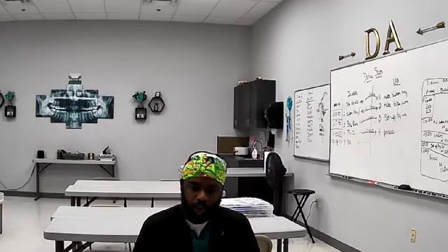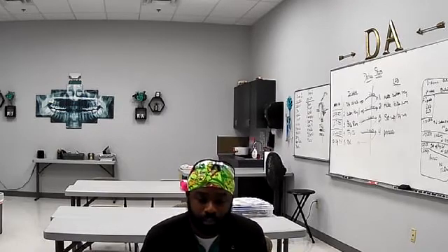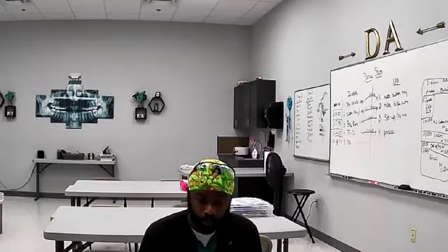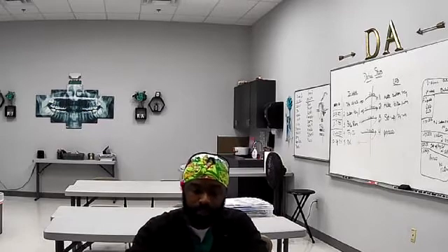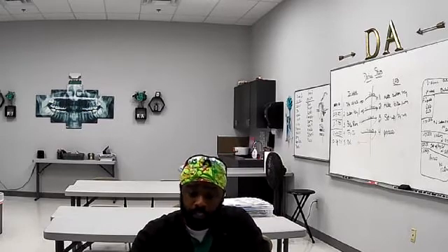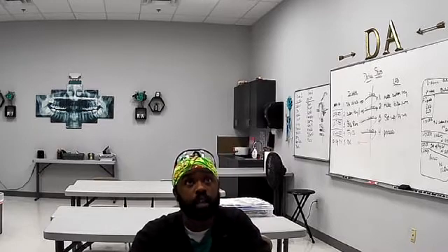So first of all, let's start off with dental radiography. Dental radiographs or X-rays are used to identify dental decay and diseases in the oral cavity, to view the health of the teeth and the surrounding areas, which is the surrounding gums and the surrounding bones.